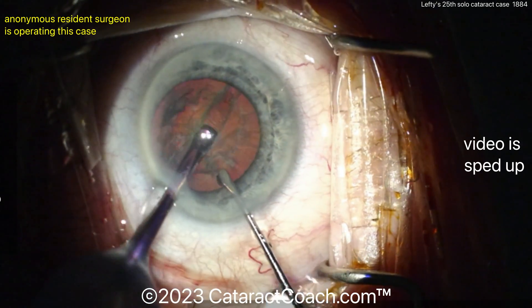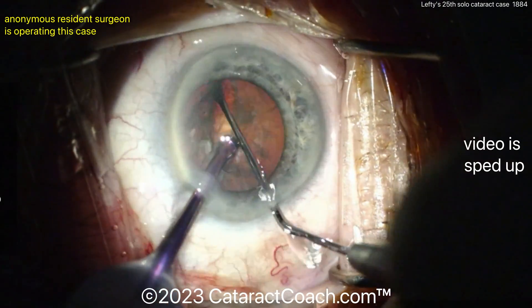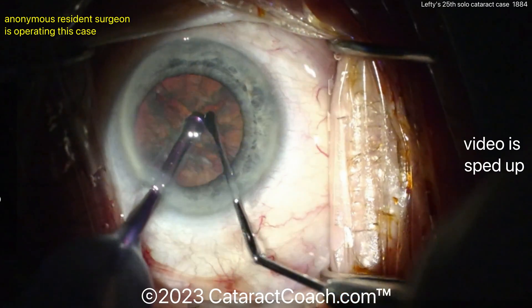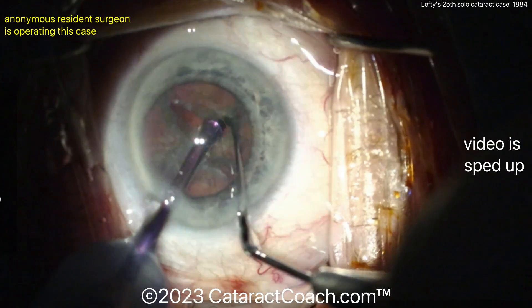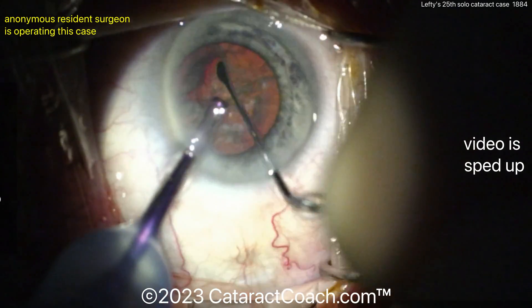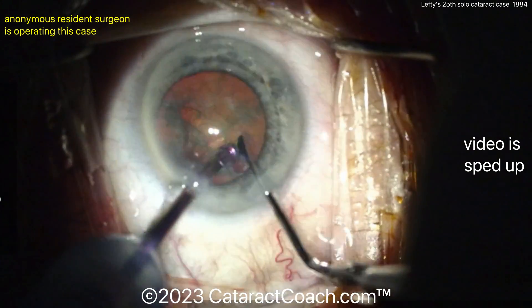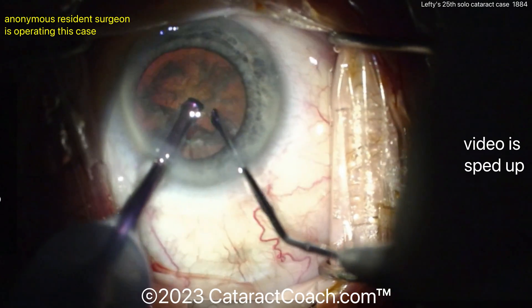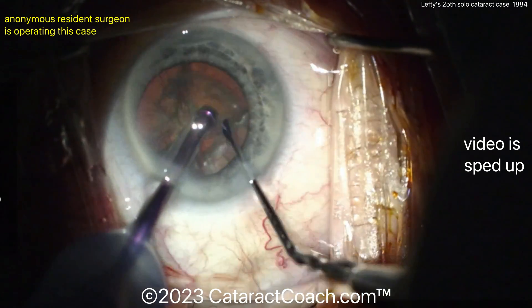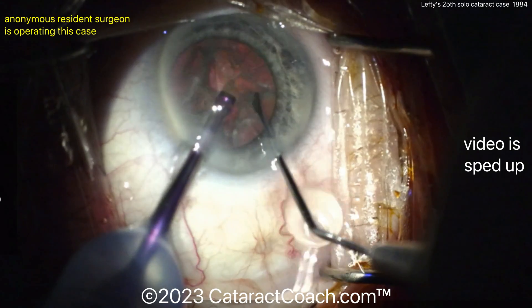Here's a nice groove there. I like going under the rhexis there — and cracked it right away, just a couple of maneuvers. That looks good. So divide-and-conquer technique — that's typical. For 25 cases in, divide-and-conquer is pretty much the most commonly used technique. I think once you do a few dozen of those and you're comfortable, moving on to a stop-and-chop would probably be a good move. We've obviously sped the video up here just so we can watch the whole thing. Very nicely done — now moving to high-vacuum mode, getting the pieces up. Very nicely done divide-and-conquer.